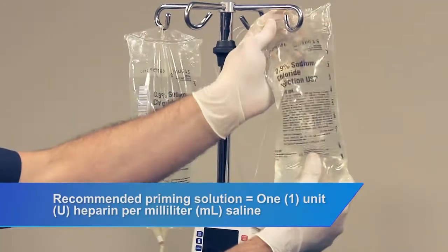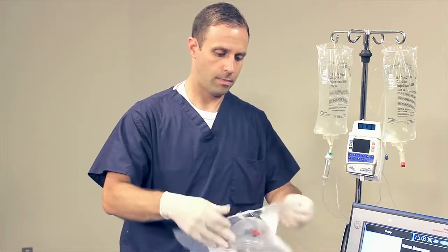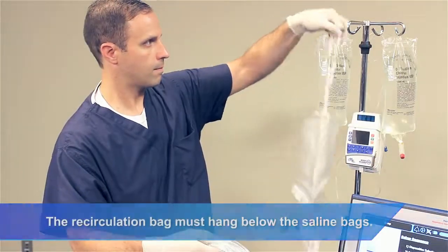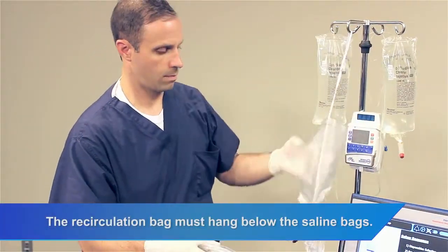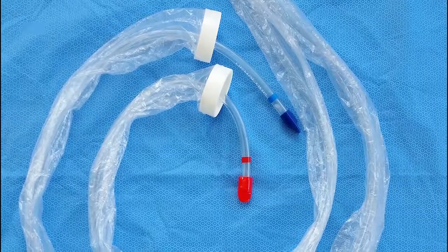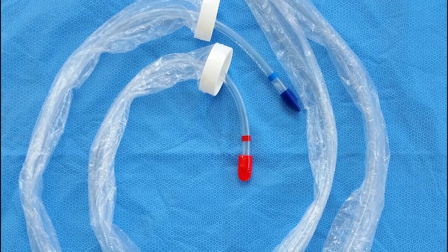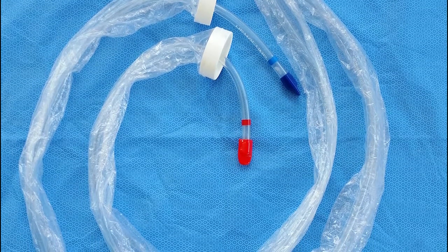Connect the IV administration set to the one-way valve and run the infusion pump at 30 milliliters per hour. Hang the heparin prepared priming solution. Open the red to patient tubing set. Hang the recirculation bag.